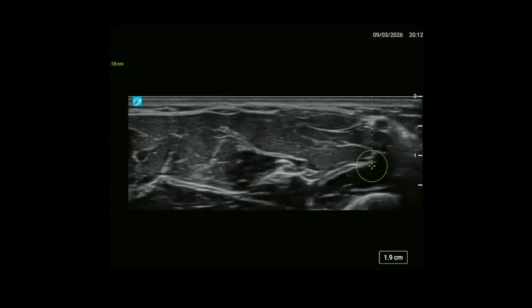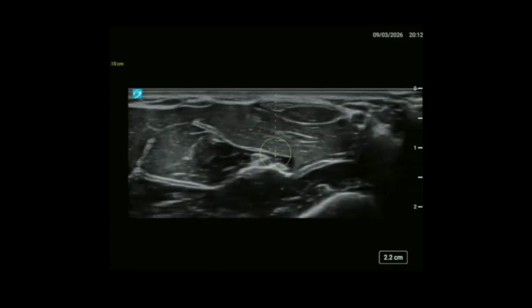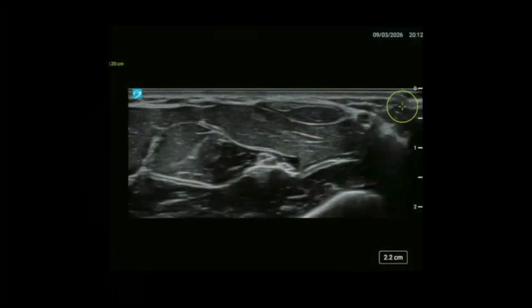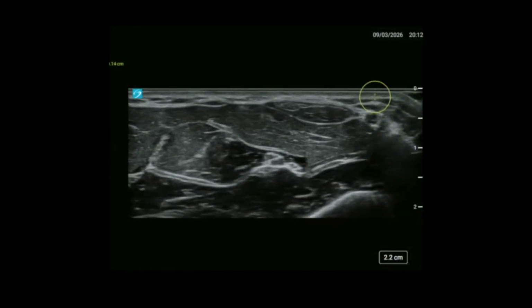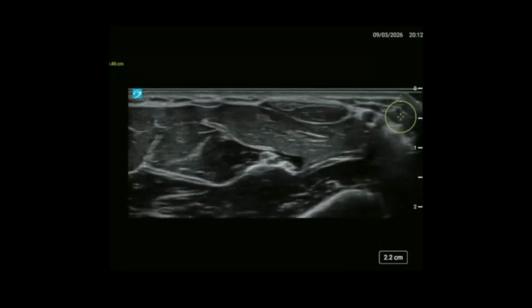In between two muscles, we've got flexor digitorum superficialis above and flexor digitorum profundus below. And again, we would block this by, I'm coming from laterally, so I would need to be wary of this radial artery, which is here, and either bring my needle below it or very carefully above it, just bearing in mind that the superficial branch of the radial nerve normally lives over here, so you don't harpoon that.